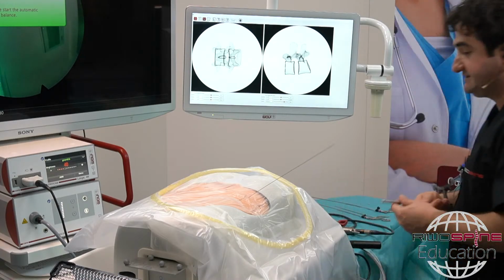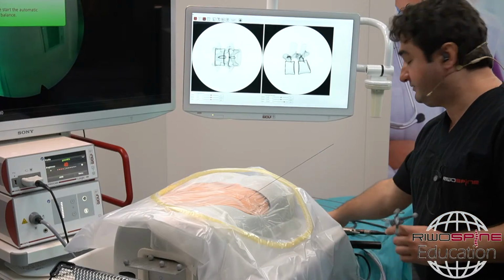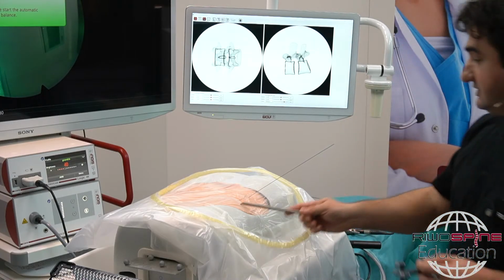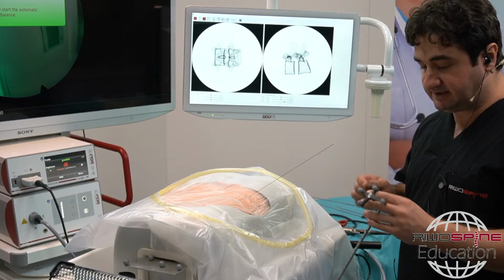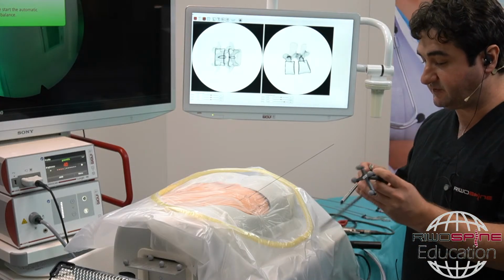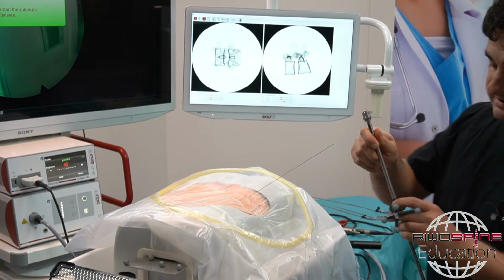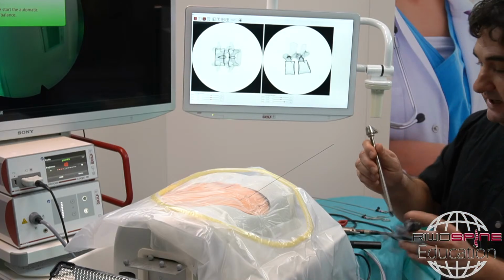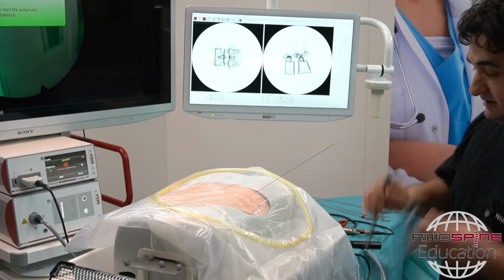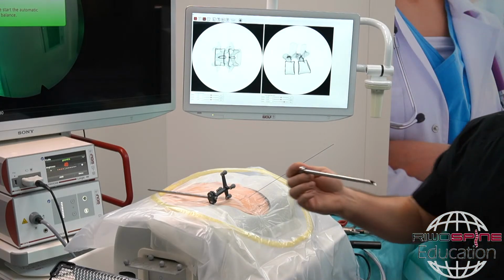Then the next step is the dilator. When we fix the dilator into the foramen, then we go with the sleeve. But for this RIWOspine model, the tracking device is fixed to the dilator. If I introduce the dilator first and try to put the sleeve, then it's not possible due to the tracking device. That's why I'm going to introduce both together, but I would like to explain a little bit about the sleeve position.